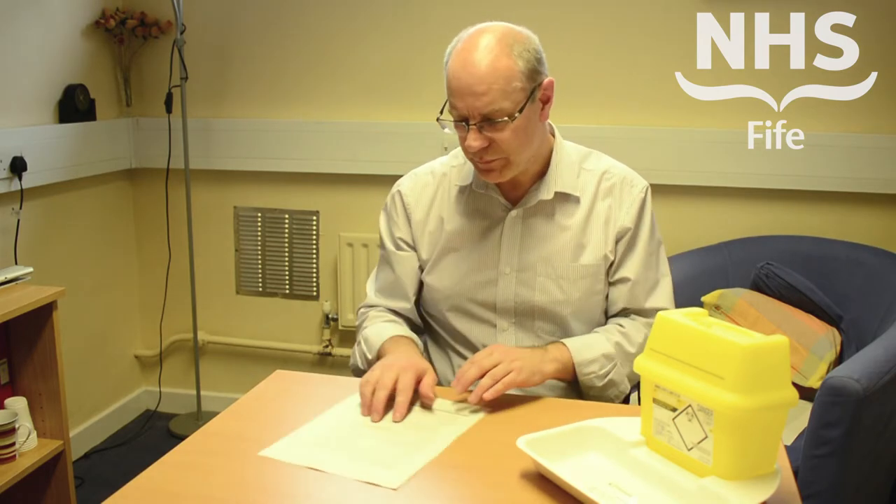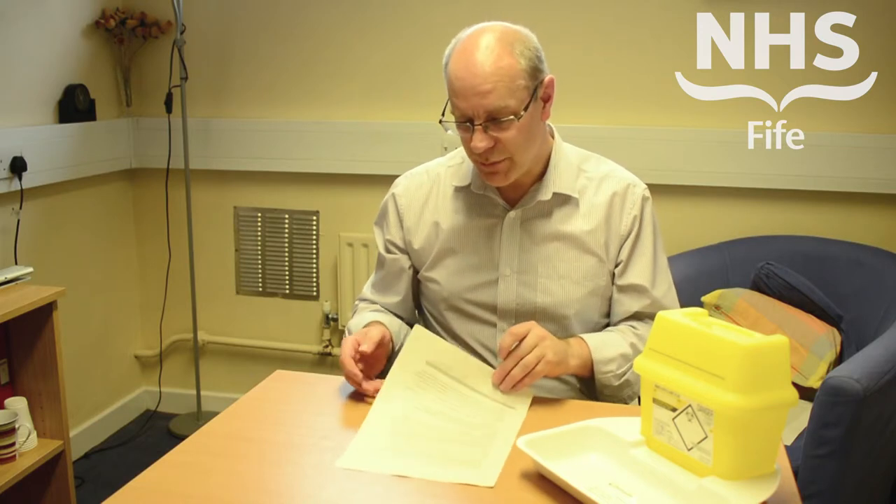In terms of sharps incidents, a key point to remember is to understand what to do in the event of a sharps injury. We have a leaflet available on the health and safety pages of the NHS Fife intranet, and we encourage you to download and read it, as it has information on what to do in the event of a sharps incident.